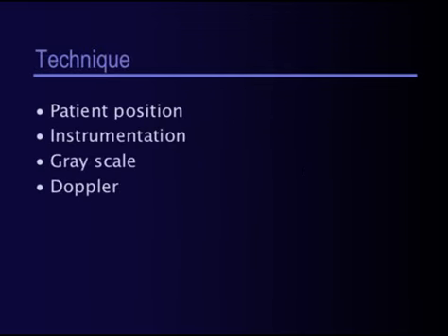Okay, the patients may be scanned supine or standing or sitting up. We can have their legs dangling over the edge of the stretcher, and we usually position their legs in a semi-frog leg position. A 5 to 8 megahertz linear array can be used for the femoral duplex study, and we may switch to a higher frequency transducer for the saphenous, since it is more superficial.